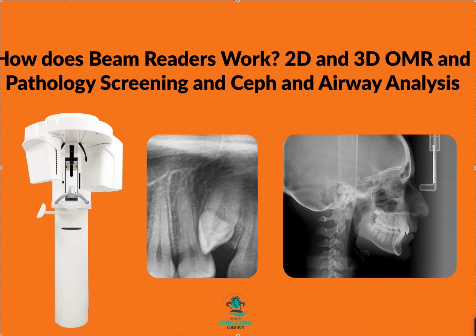It's different if someone in your state or your country of licensure signs off, saying it is fine for you to go ahead and treat with that supernumerary or that pathology or that odontoma or that condensing osteitis. You're okay. That person is more specialized than you in that area, they did an official report, and they said it was okay. If something happens, it's on them, not on you. I see this stuff all the time. You wouldn't believe how many people just start treating, saying, oh, I think it's okay. So anyways, that's the underlying idea.